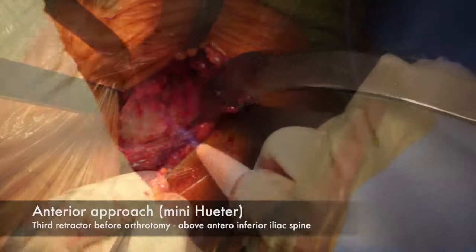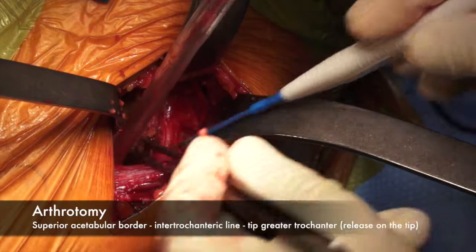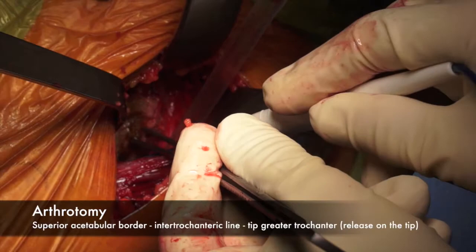Arthrotomy. 1. Superior acetabular border. Intertrochanteric line. Tip of the greater trochanter. Release on the tip.